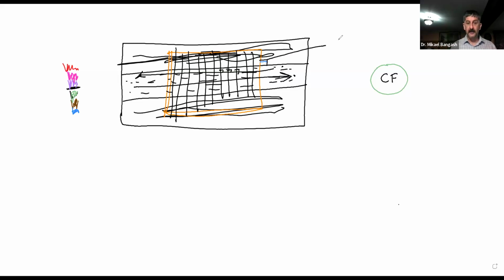What does that 90-degree angle tell you? That you have a 0 Doppler shift. And that's why what appears is the color on your color scale that represents a 0 Doppler shift, which is the color of the baseline, which in all maps is pretty much going to be black. Did you guys get that?